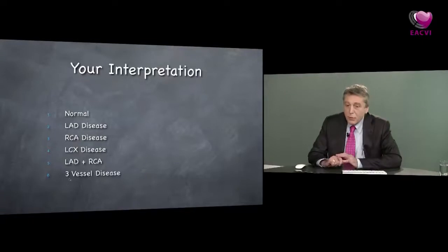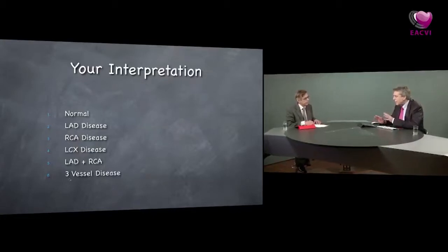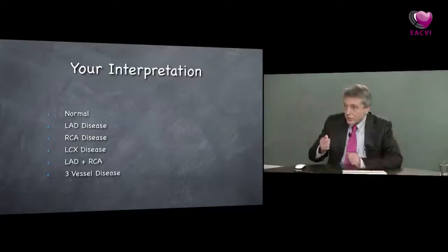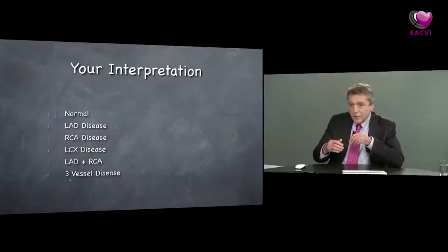Well, the most important thing is the contrast administration and the contrast level. Obviously the machine settings have relevance as well, but you've got to get the contrast level correct first of all. And of course, that's much easier to do if you're doing it with an infusion, because you can change it and see the effects of it. So if it turns out that, as I showed you previously in that short axis view, the contrast looks very low in the LV, then you need to boost it. If, on the other hand, the contrast is very bright near the transducer and then you've got shadowing beneath it, then you need to reduce the amount of contrast because it's causing attenuation.